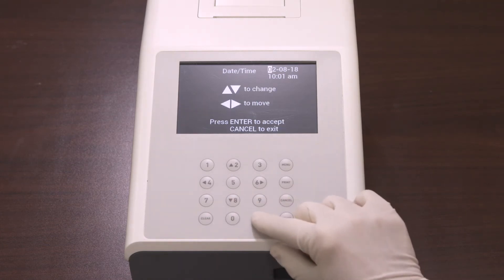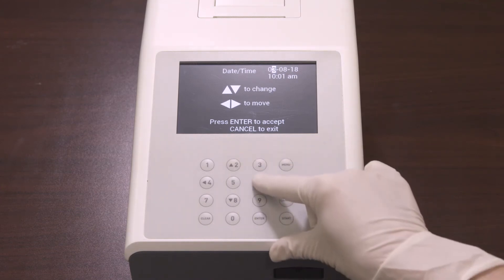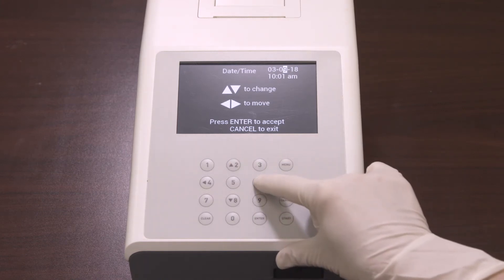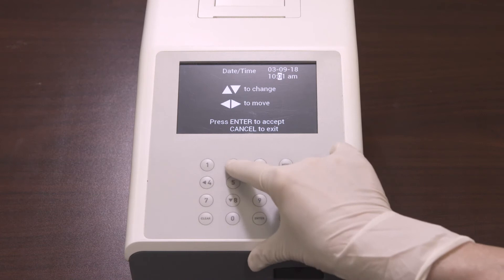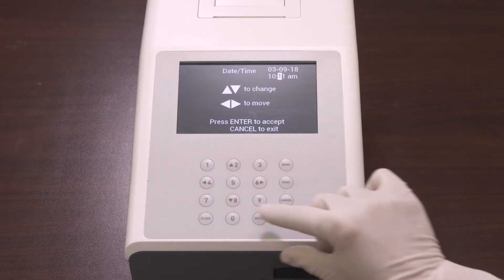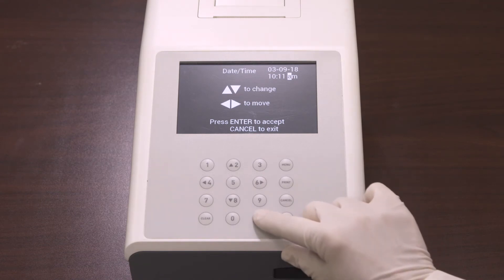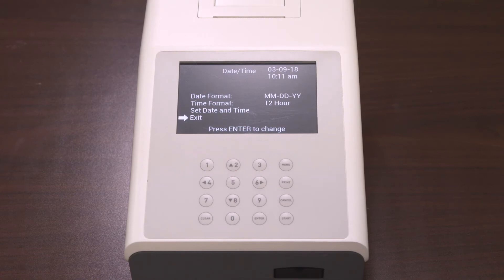Select Set Date and Time and press Enter. The first digit to be changed in the date will be highlighted. Press the up or down arrows to change the number one at a time, then press the left or right arrows to progress to the next digit to be changed. Make sure that you enter the correct date. Once done, press Enter to save the changes and exit the screen, or press Cancel to discard any changes and exit the screen. Make sure that the date and time setting is correct based on the date format and time format selected.